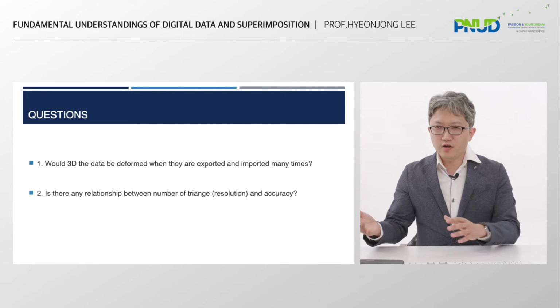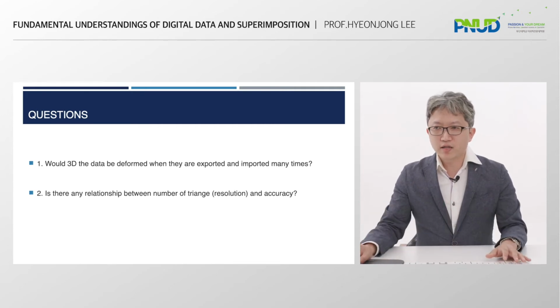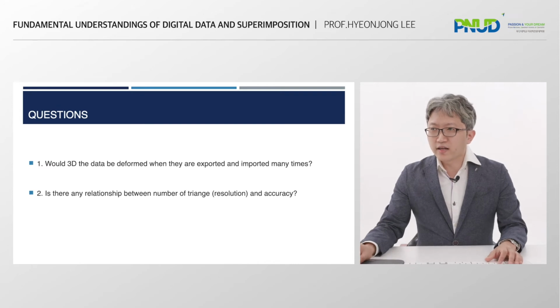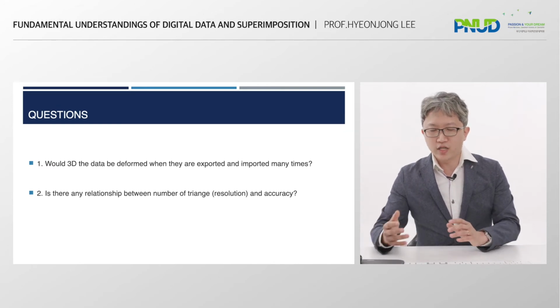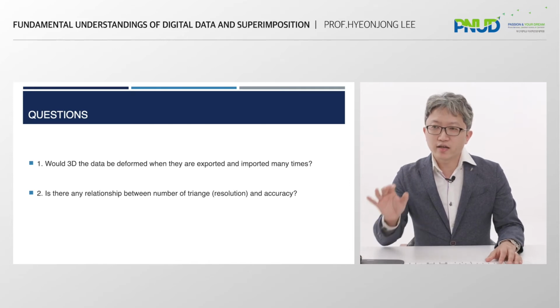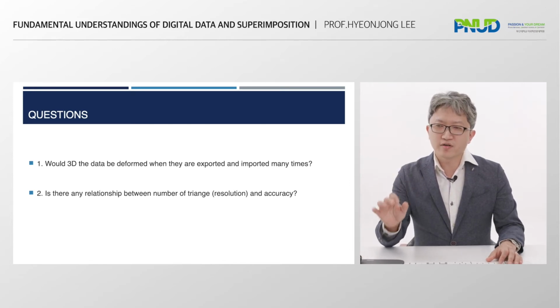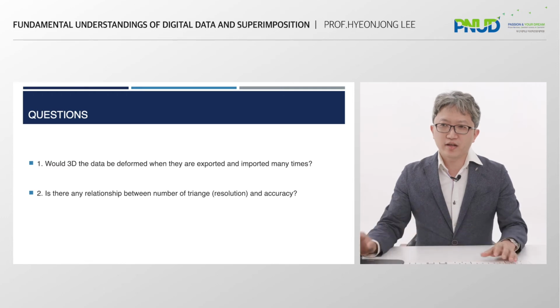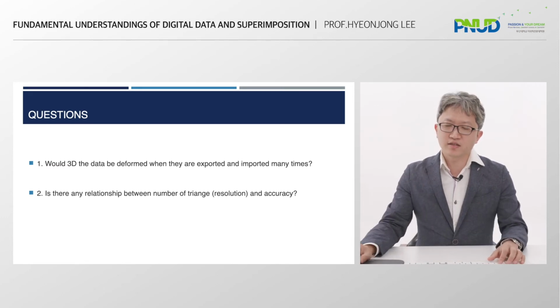And if we import many times, would it be deformed or not? So basically, even if you import or export like 10 times or like 100 times, the information, the numbers, don't change. So actually it doesn't matter that much. Sometimes it could matter, but basically the numbers as they are don't change.